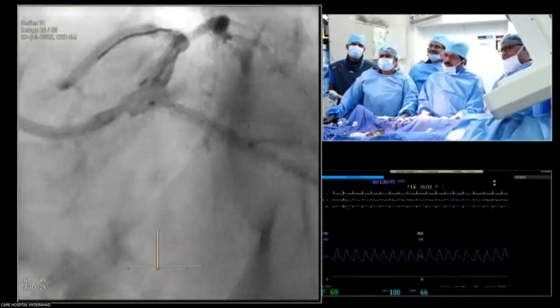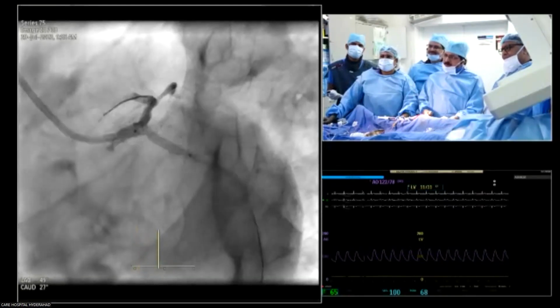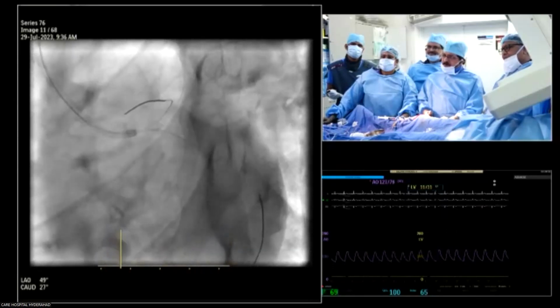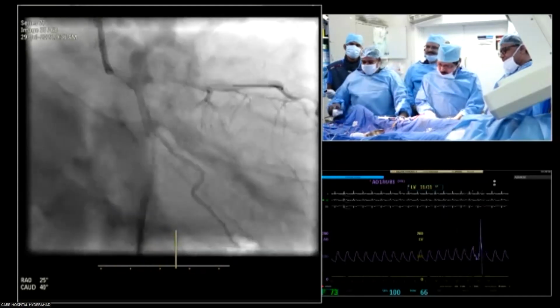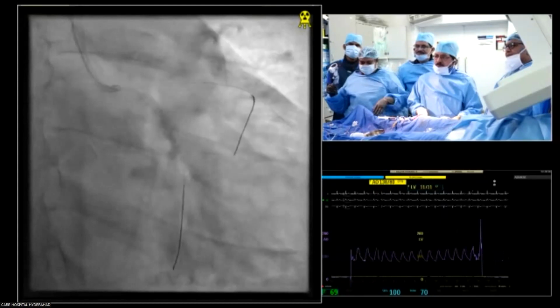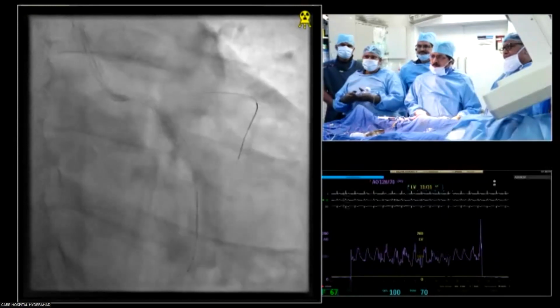And so they did it, and now with a favorable angle from the left main. We are, I guess, in the land of severe LV dysfunction type patients. If you have normal LVs, then it's quite safe to do whatever you choose to do. But in general, if you're going to encumber a myocardial territory by doing a retrograde, you're going to encumber both the collateral territory as well as the antegrade or target territory. In those situations, my practice is to try to do all of the other lesions first and then decide on that next one.